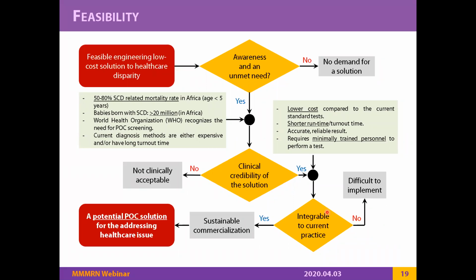I'm going to briefly explain. We all have seen quick tests for diabetes and pregnancies. You don't have to go to the doctors. You can actually buy the tool and test it yourself. Those kinds of devices are called point of care testing. What point of care testing does is take the diagnosis capability from labs or doctors and put it in general people's hands so that more people can test themselves. That increases the number of people that can be diagnosed and screened and get accurate and better healthcare.